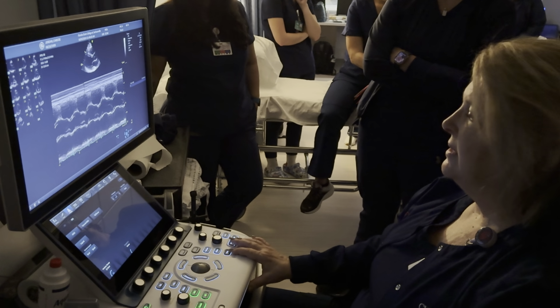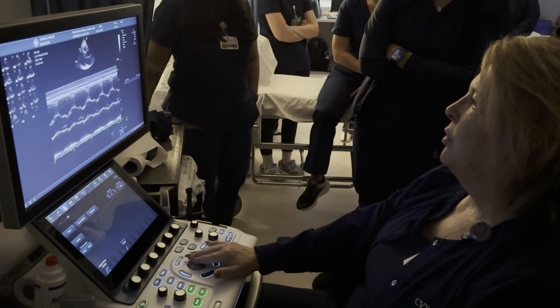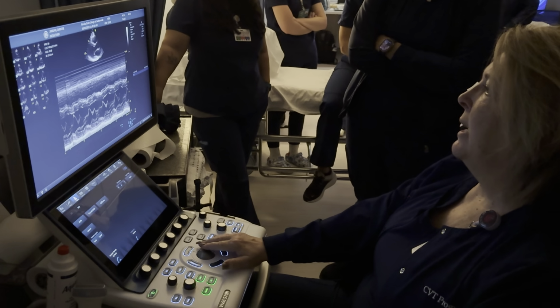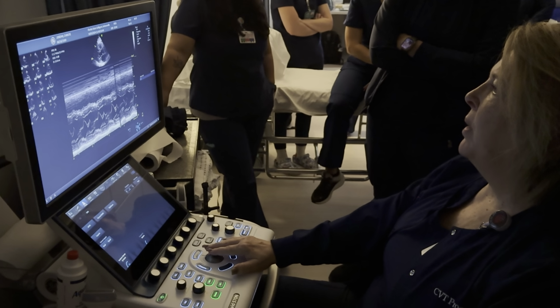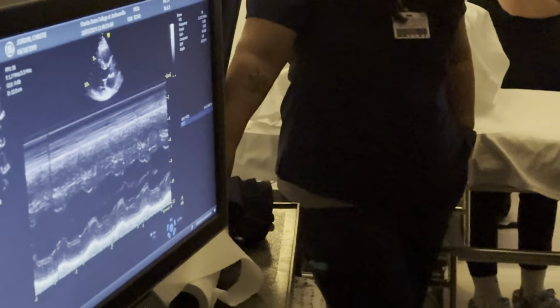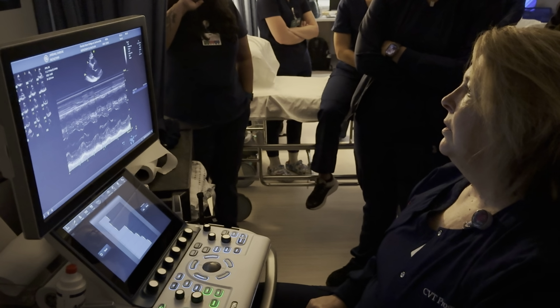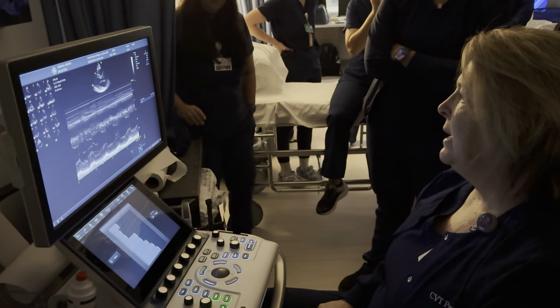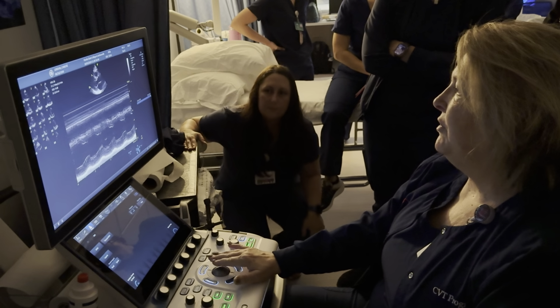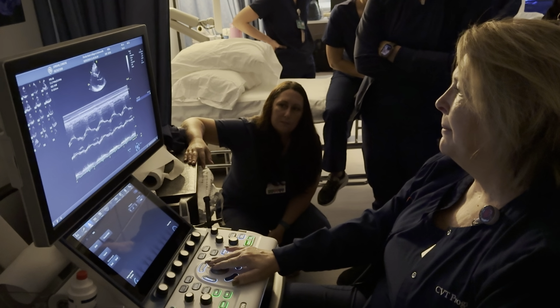I have shown you a hint of what you can do if you're holding that particular image. I don't know if you guys are ready for that, but if you want to try to practice that, you can. Otherwise, I would just freeze and do your M modes individually. See how I kind of turned down that right ventricle. If you haven't seen this yet, I'm going to talk to you guys about this for Thursday lab. We're going to do this today.